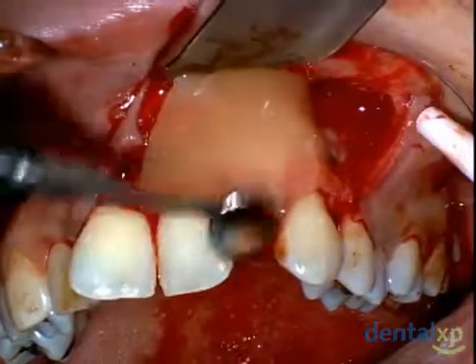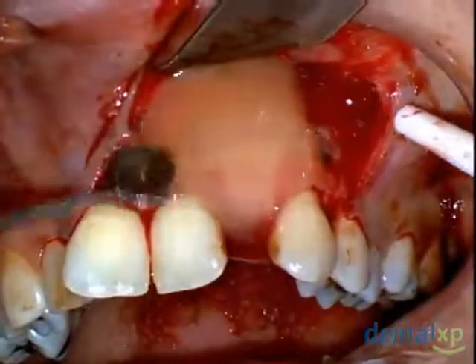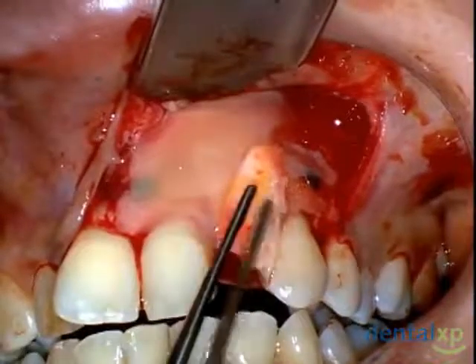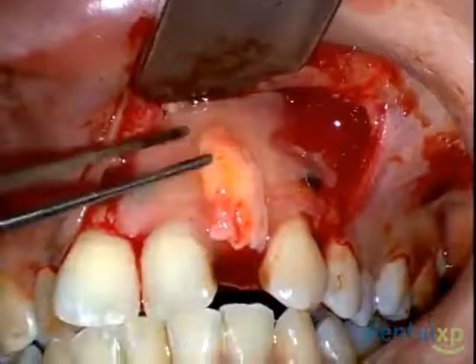The fibrin first, mixed with the bioactive modifiers, then the collagen membrane over the top of that, and then once again the fibrin over the collagen. The final piece of the puzzle is the original connective tissue graft, the autologous connective tissue that was harvested from the maxillary left palatal region.